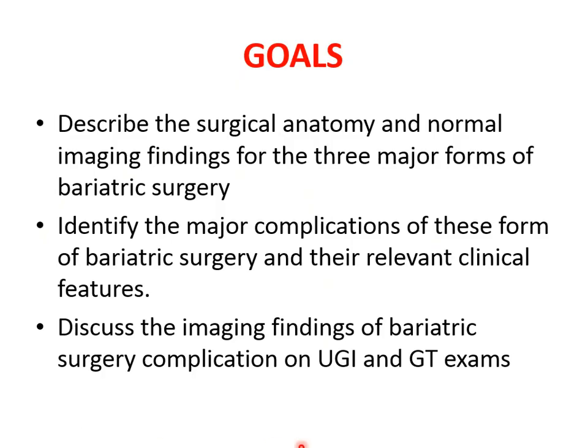Goal. What is the goal of our seminar on bariatric surgery? First of all, describing the surgical anatomy and the normal imaging findings for the 3 major forms of bariatric surgery. As I told you before, there are many types of bariatric surgery, but I would like to focus more on the 3 major ones that have been commonly and repeatedly used in the last decades. The other types I will just talk about briefly.